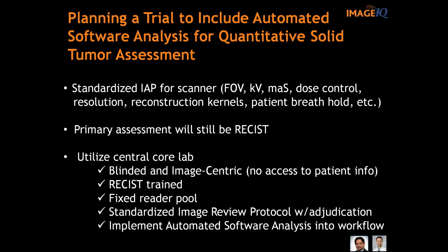One of the questions we've got is, what kind of measurement variability do you see when people are using RECIST? And I think, Amit, you covered that a little bit, right? So you can see some pretty strong variability there. Yeah, it averages about 14 to 15%. I showed you some of the drastic cases where it's like 140%, but on average it's going to be about 15%, which depends on your perspective. But the RECIST criteria says 20%, so it's pretty close. You're going to create some issues there.